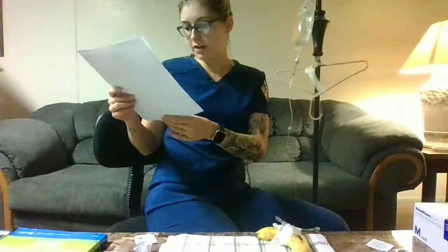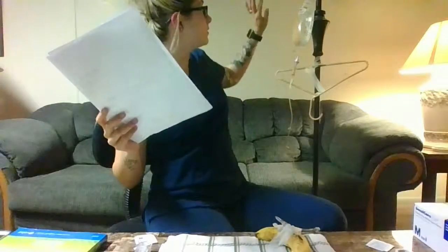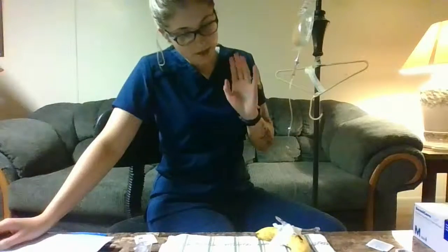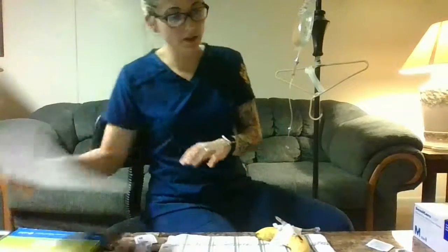and it says saline lock after second liter of 0.9 normal saline. So pretend this bag is empty. That's all done. So we're going to have to do a saline lock. First thing I want to do is the 2 patient identifiers. So check the wristband, ask them their last name and date of birth. Compare it to your MAR, make sure you have the right person there.